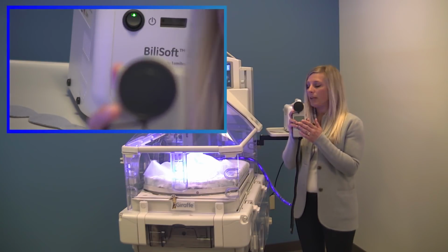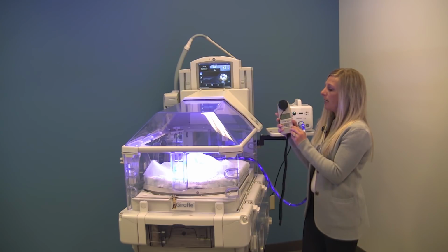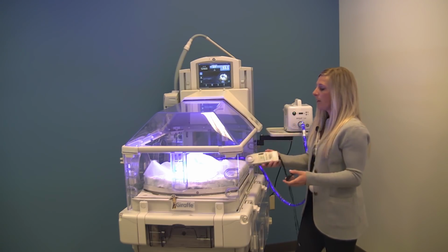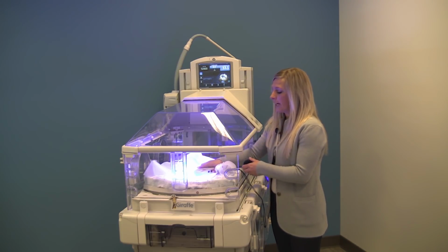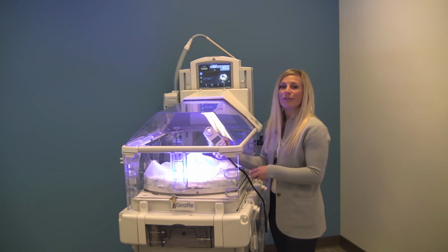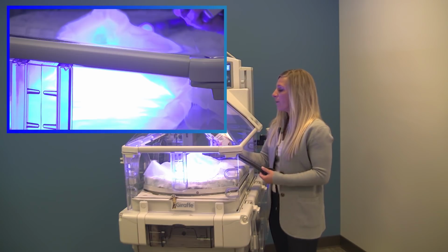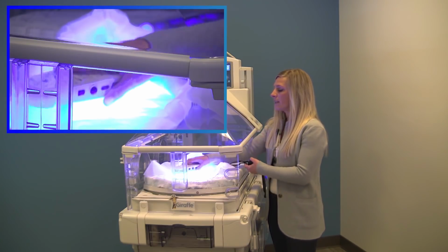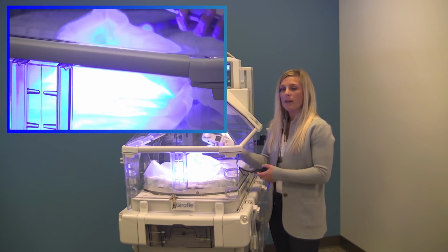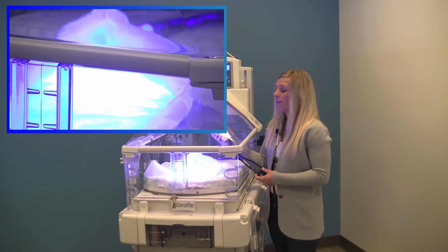We'll talk about the bili meter a little bit later, but ultimately what you'll have to do is turn your bili meter on, let it calibrate with the cap still in place, undo the cap, and then do your spot check. So you really do want to make use of locking in that circle button. Otherwise, your reading, once you lift up, will start changing with the ambient light. So we got 51.3, and then I will release and take my second check. And so you basically go across the middle and average that reading out. So for that, we will do 55.2.